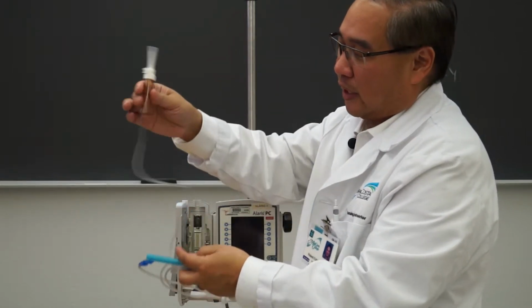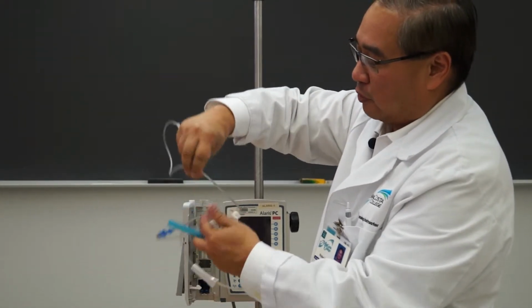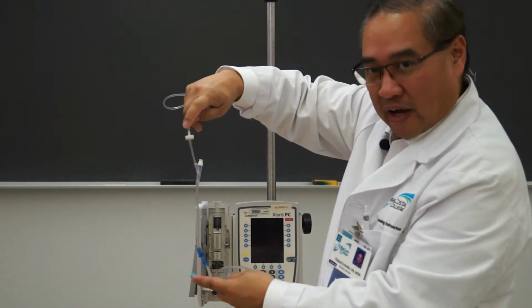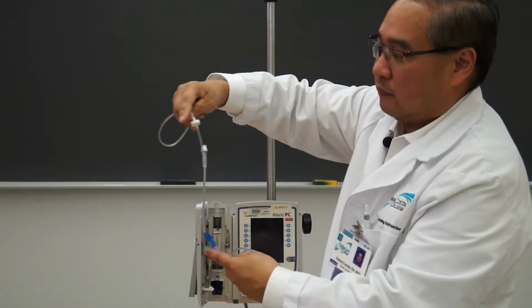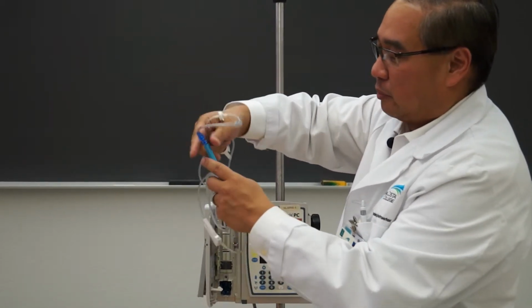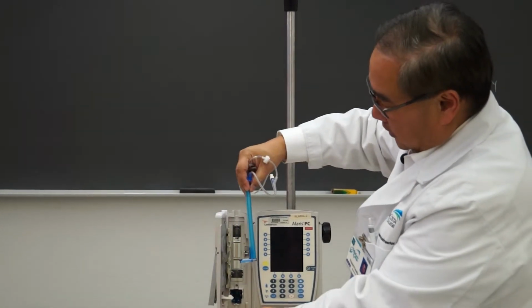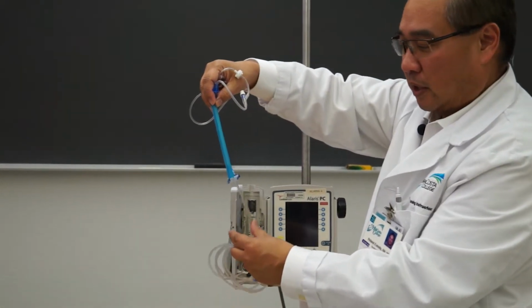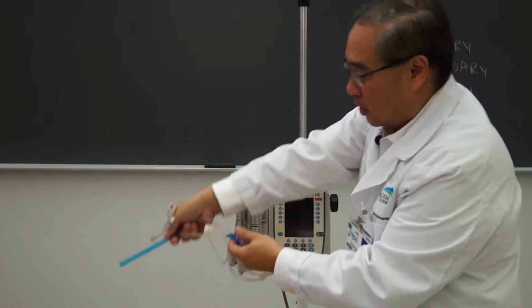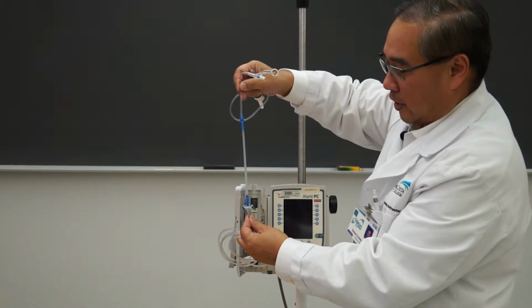Okay, I'm going to control this end here while I am checking the tubing. I'm just basically going through my hand. Here is the white one-way valve I mentioned earlier. Right below that is a Y site. This is the part that I showed in the previous video that went inside the machine, which we'll take out later on. And there's a blue sheath here that holds the flexible tubing, which can be discarded, leaving you with this right here. Remember, it's flexible, okay?